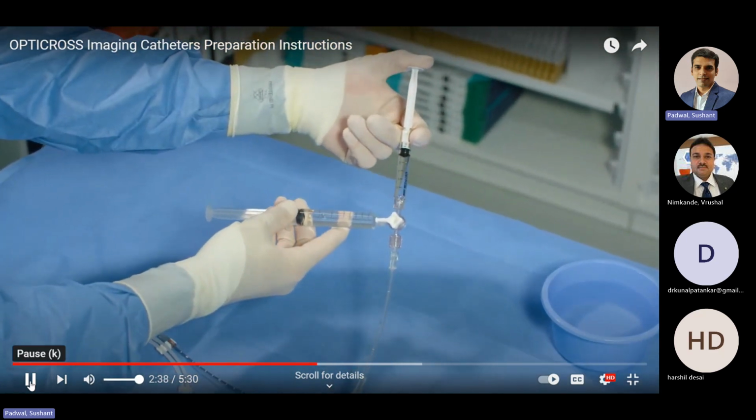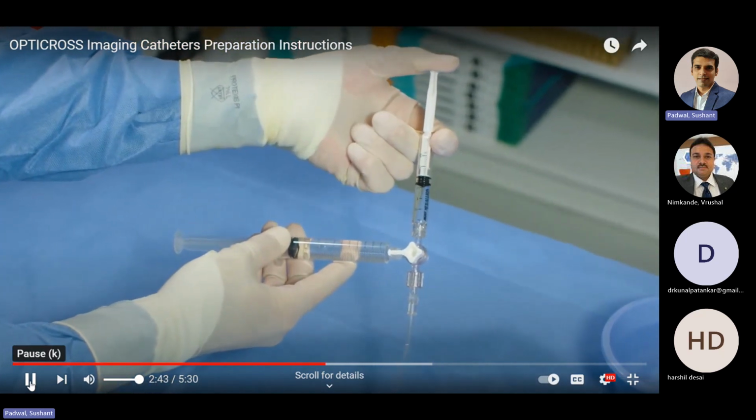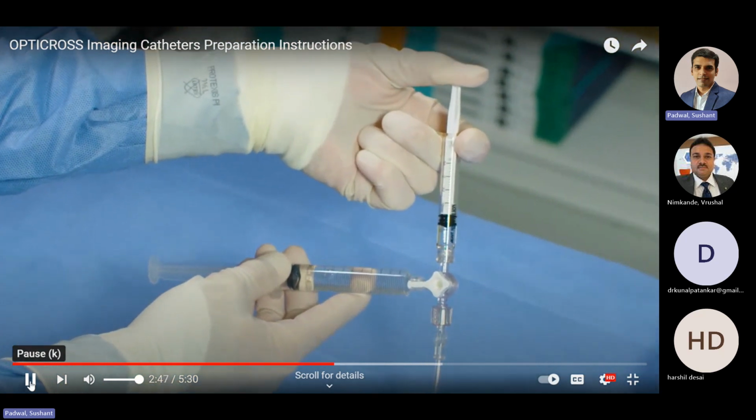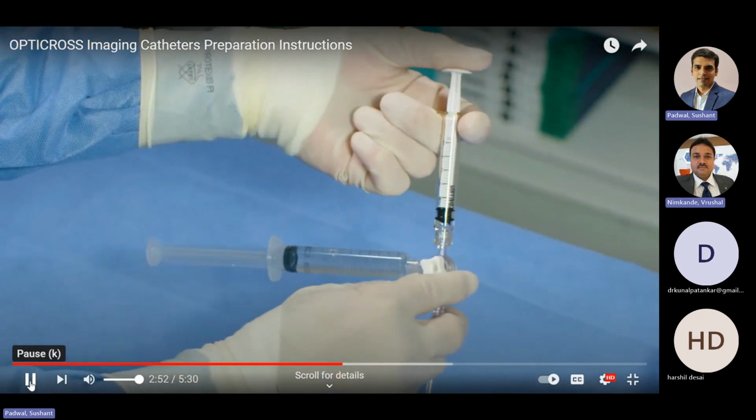Slowly flush the imaging catheter using the 3 cc syringe to purge the air. The reason to pull out this telescope before flushing the catheter is that the imaging window should be emptied out completely. Just imagine if you keep the IVUS transducer along with the shaft in that imaging window and you are flushing, you will get tremendous resistance flushing the catheter, and there could be bubble entrapment at that imaging window site.